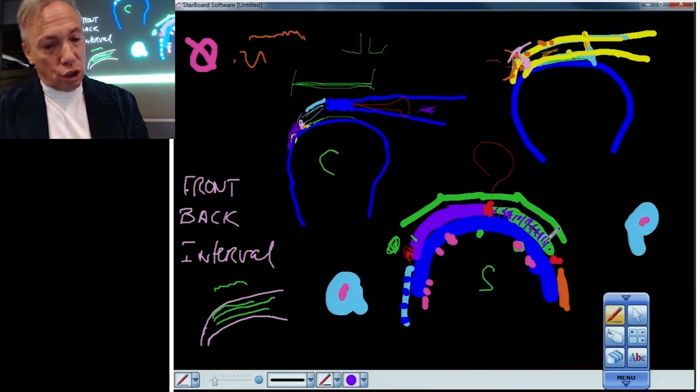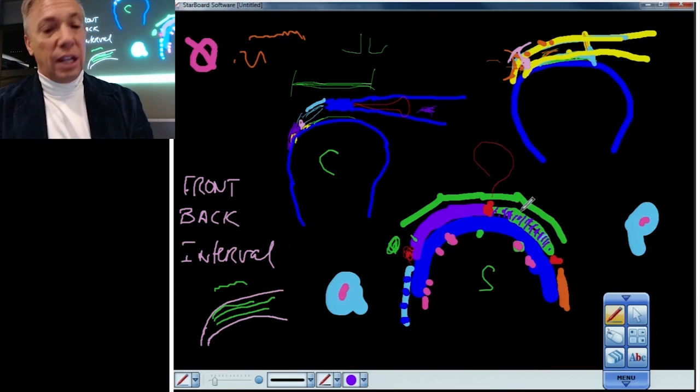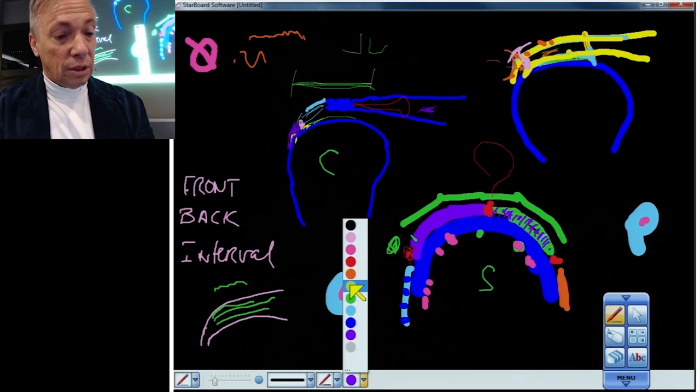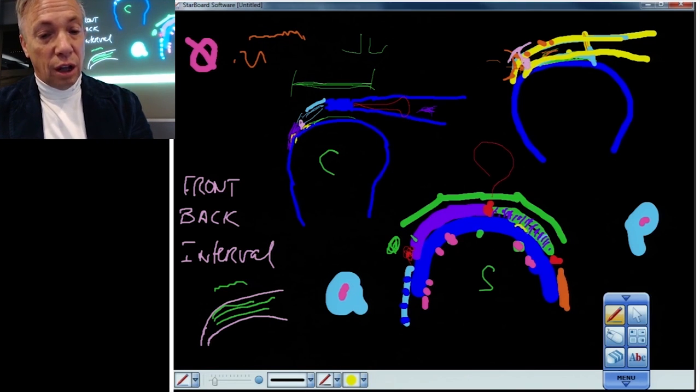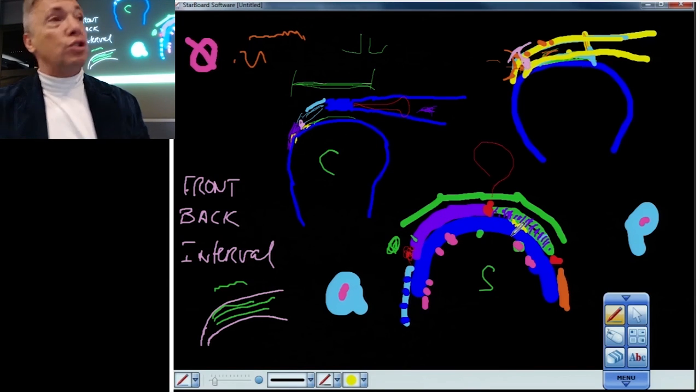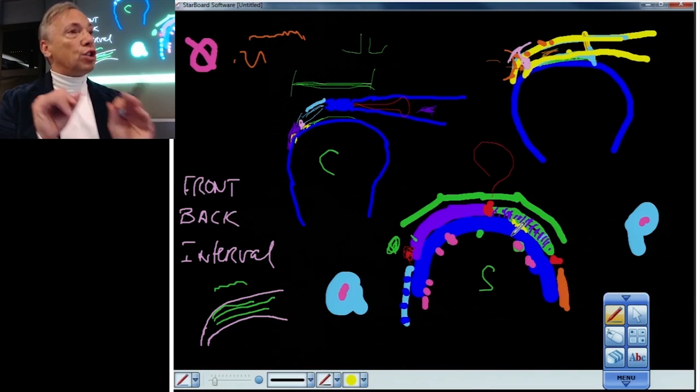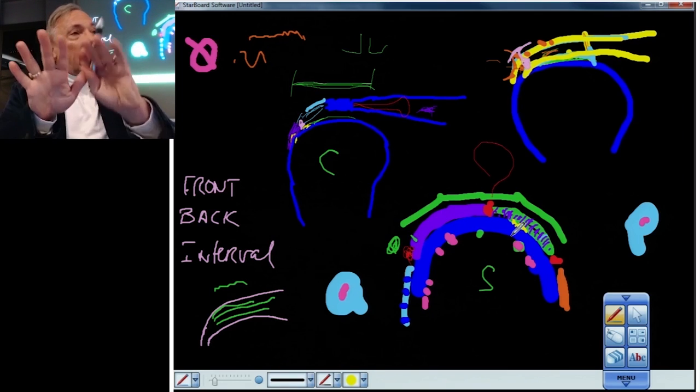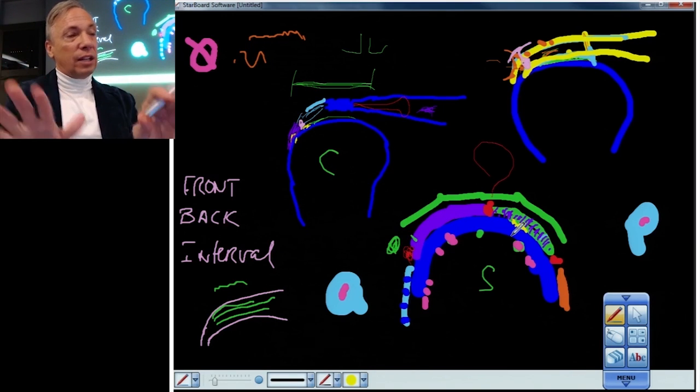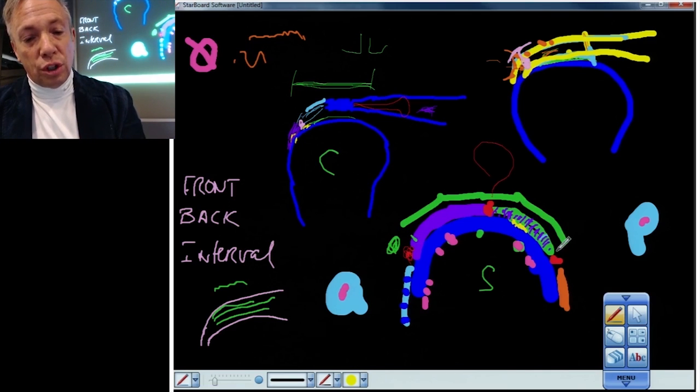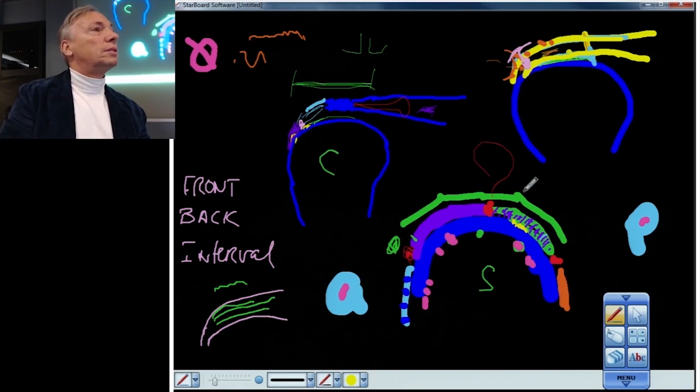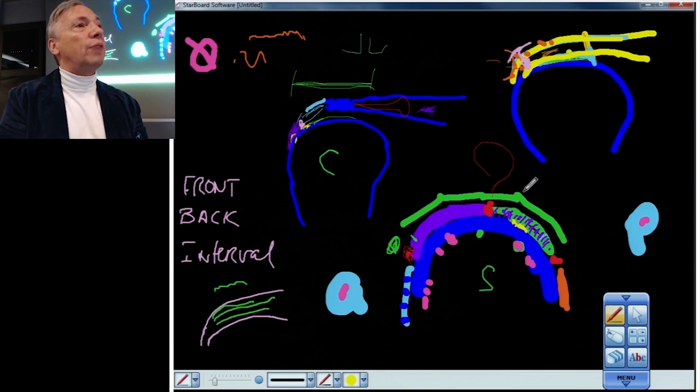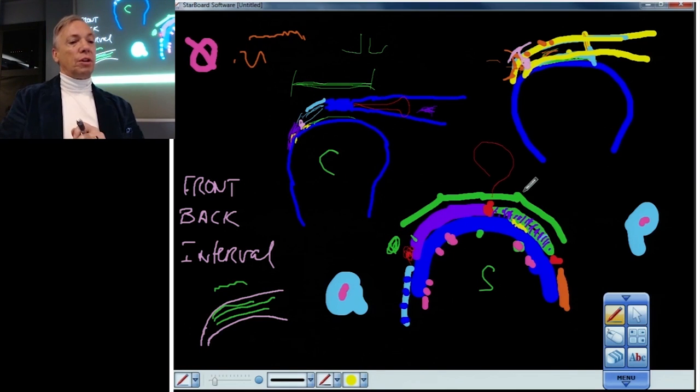But it is extremely common in internal impingers to see partial thickness under surface tears along the deep portion of the infraspinatus with pitting and pseudocysts underneath those, and a swollen infraspinatus with the hair spread apart and a little signal between them and a little bursal signal around the outside. And a little bit of posterior superior labral fraying. And that defines internal impingement.